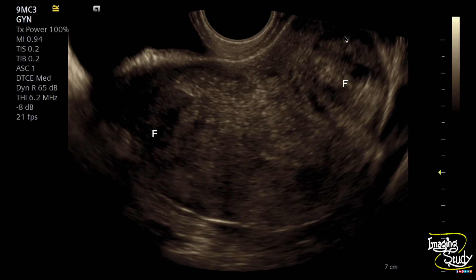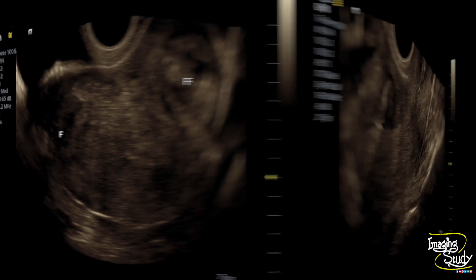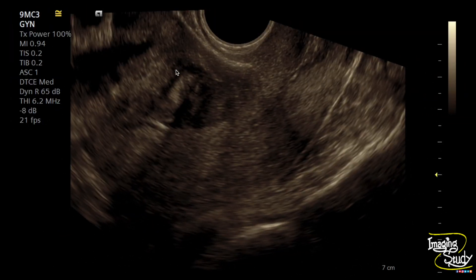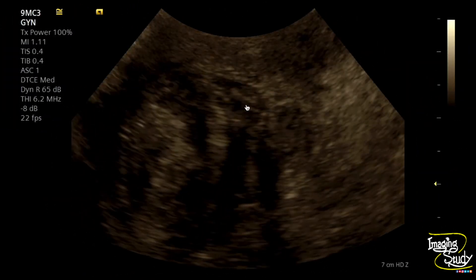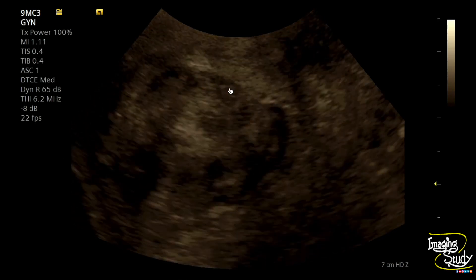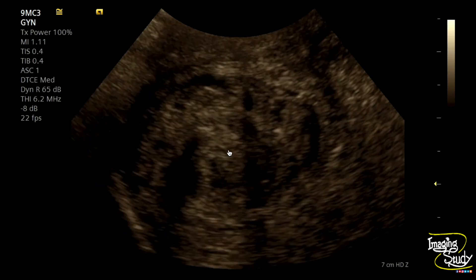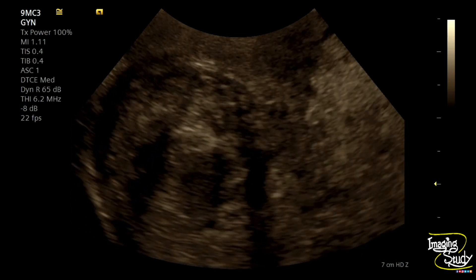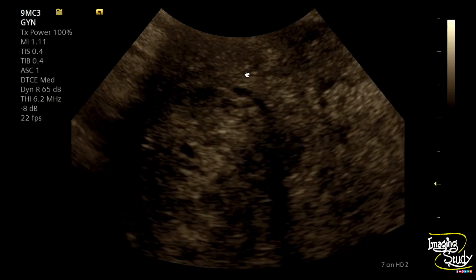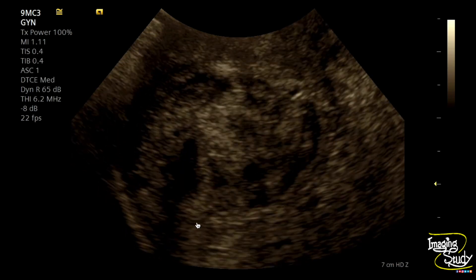Here's the picture with the transverse section of the uterus — you can see these are the fibroids at the anterolateral myometrium. Now let's magnify one fibroid to evaluate the findings more. You can see this is the intramural one and it looks heterogeneous — these are the hypoechoic areas and these are the hyperechoic parts. There may be presence of calcifications which we can't appreciate here. You can see this hyperechoic thin line is the pseudo capsule.